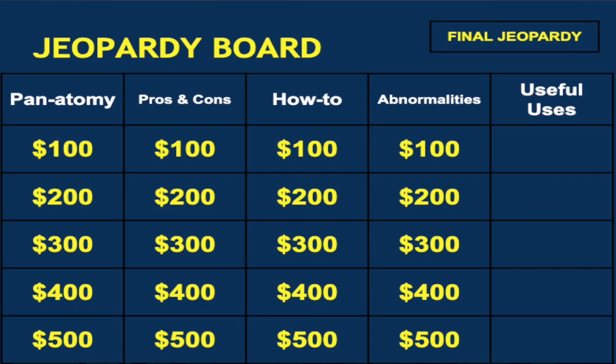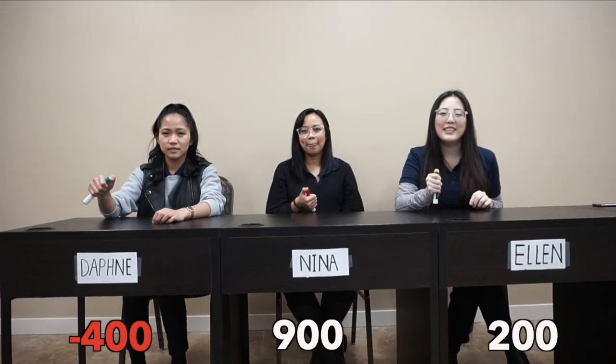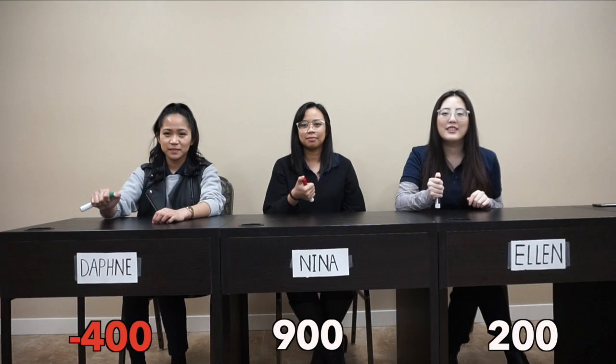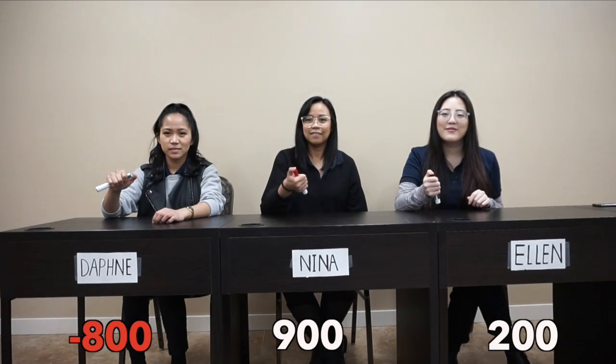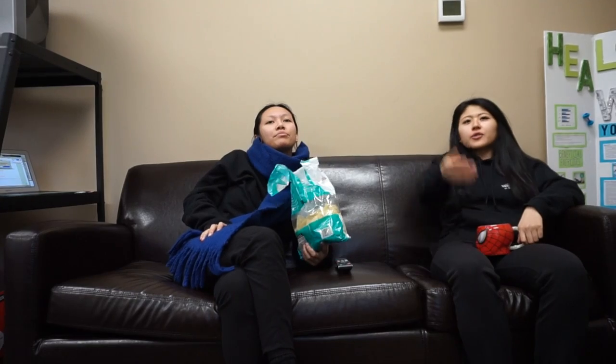How to for 200? Type of lead aprons recommended. Ellen. What is a collarless lead apron? Correct. How to for 100. Explaining the procedure is part of what? Daphne. What is patient preparation? You're correct. How to for 500. Instruct the patient to position this on the roof of the mouth and keep the position during exposure of the receptor. Daphne. What is the X-ray film? Nope. Ellen, Nina. Ellen. What is the tongue? Correct.